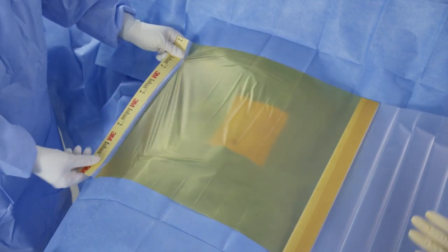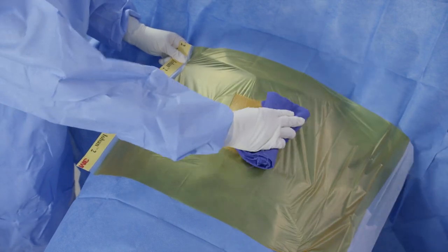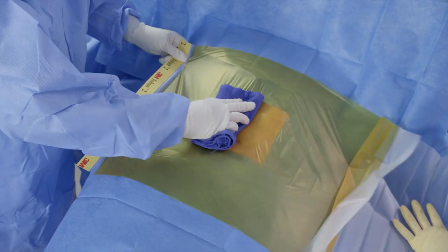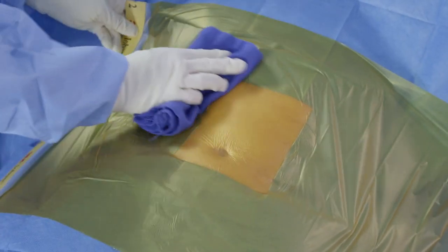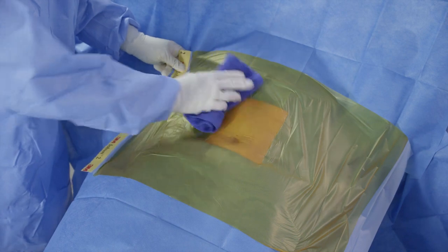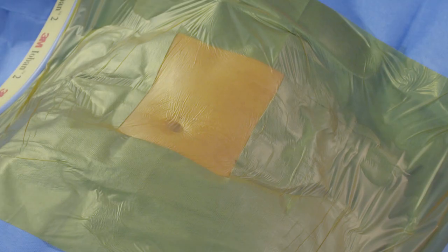Position the drape over the intended incision site and adhere it to the patient using a sterile towel or a gloved hand. Be sure not to stretch the drape when adhering. Press down firmly on the film first along the intended incision line to ensure good adherence and achieve optimal antimicrobial action. Follow by smoothing the film in place firmly and without tension, working away from the intended incision site to achieve adhesion that is as wrinkle free as possible.